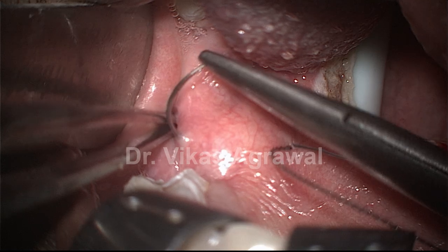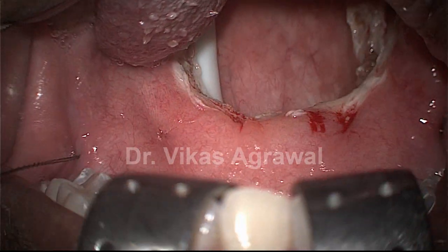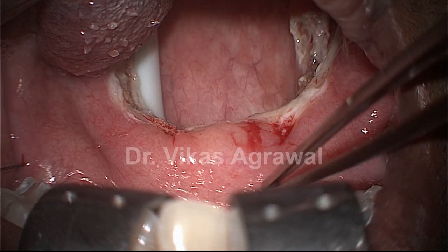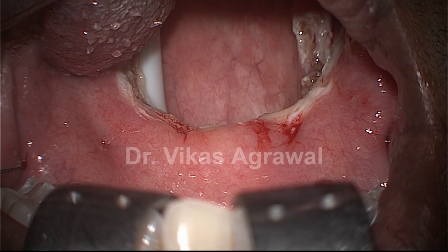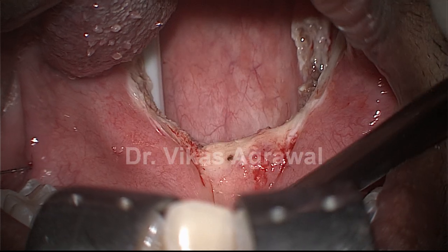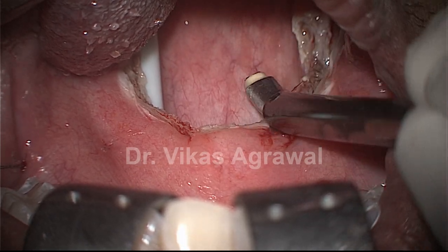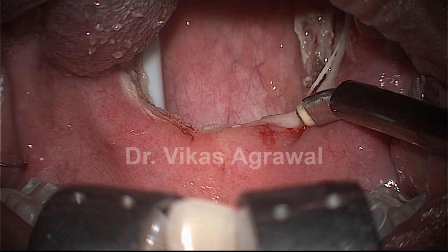That is the suspension bridge which will help support the soft palate — one pterygomandibular raphe to the other pterygomandibular raphe. This soft palate now cannot collapse; it cannot go behind. It can still go up because it has to go up while swallowing — that is the action of the levator palati, which is above this and will still work. The extra part of the soft palate has already been removed, the anterior wall of the pharynx has been transposed laterally, and this is the anterior leg.